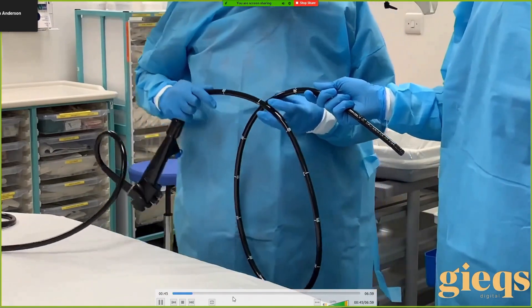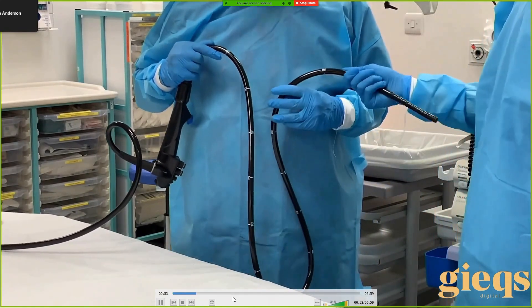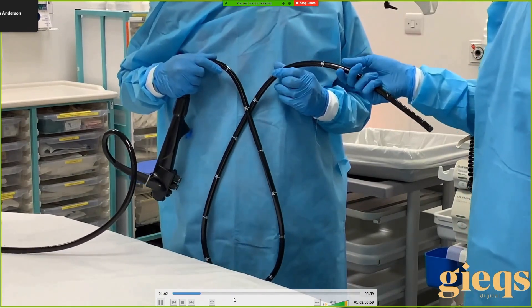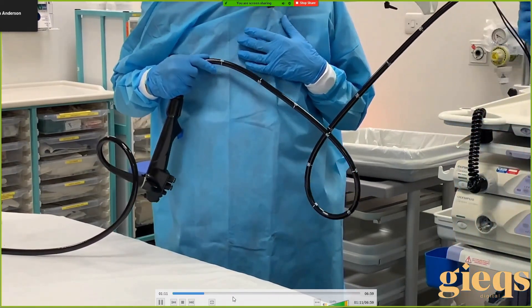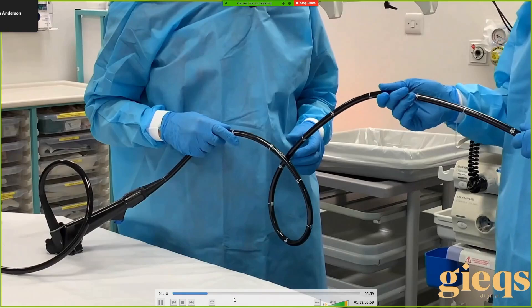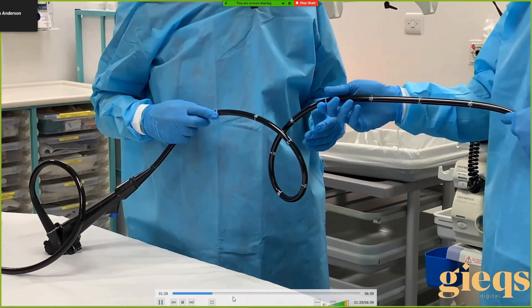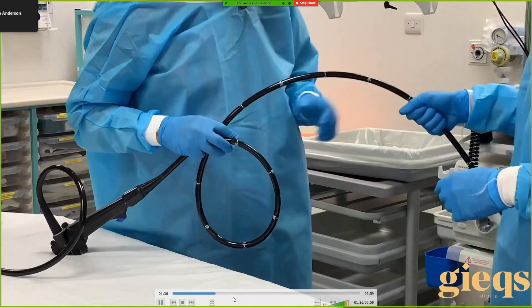What happens when you torque the instrument? It's either going to make the loop worse or it may resolve the loop. If the patient is already uncomfortable and you apply the wrong torque, you're tweaking the mesentery and making it worse. So probably torque is not great in that situation — you want to make the patient comfortable first. Pull it back, make it smaller. The question is how far back do you pull it — until the patient is more comfortable.